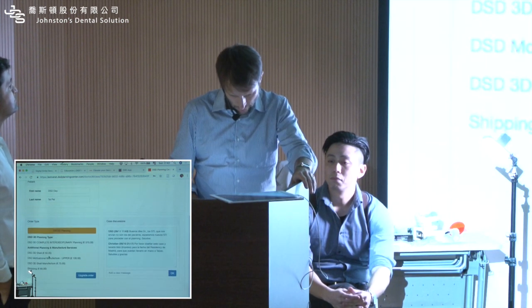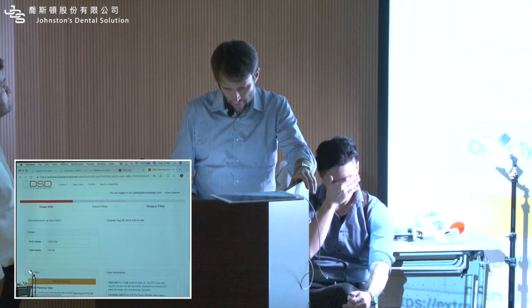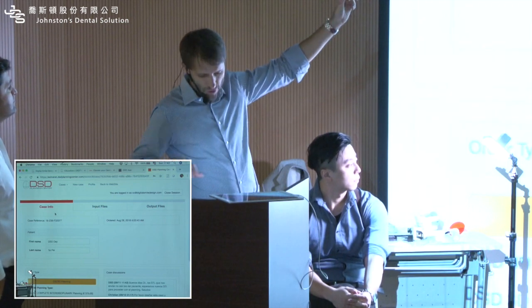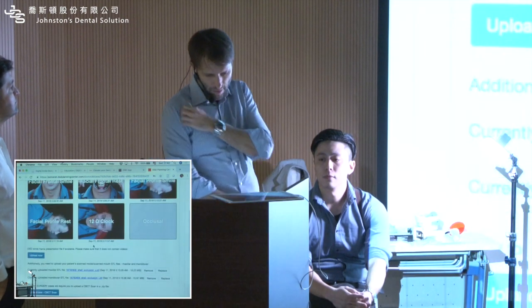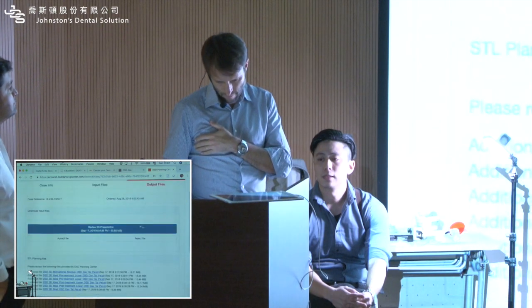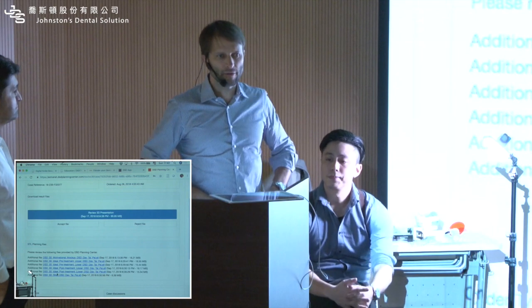This is all the information of the case. And every case has 3 windows here. The info of the patient, the files the dentist sent. So here we go. This is what the dentist sent. And this is the files that you received. The presentation and all STLs, open STLs.